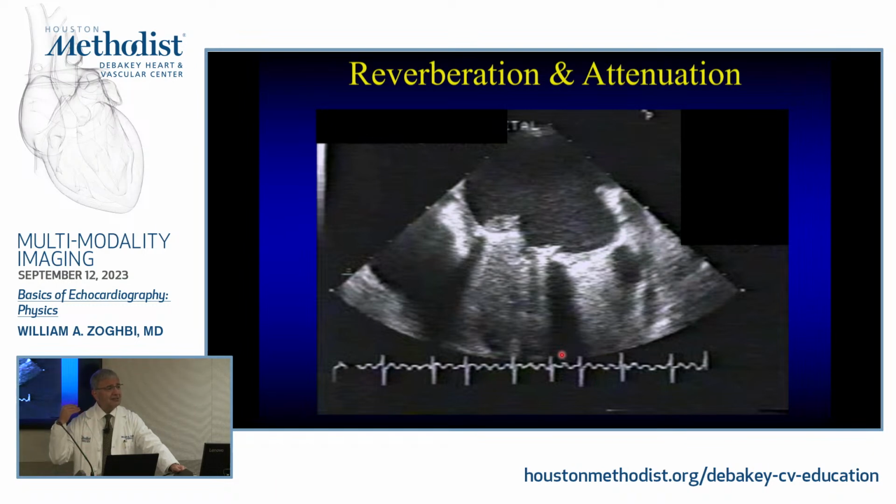And I listened to my sound coming back, being reflected. I can tell how far it is. Also, you can tell how far a thunderbolt is by waiting for the time that it takes, right? I mean, that's sound. But just imagine if I keep screaming, I will never hear my echo coming back, so I'll be very confused, right?